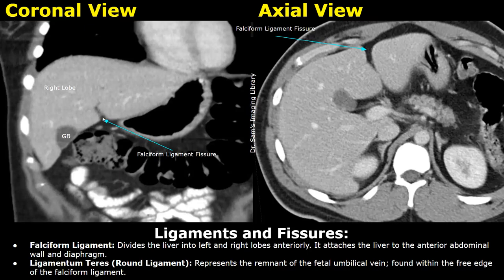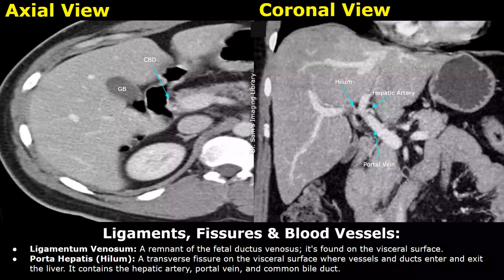Here we will get a better look at the ligaments and fissures of the liver. This hypodense dark line is the falciform ligament fissure, which divides the liver into right and left lobes. The ligamentum teres is a remnant of the fetal umbilical vein; it is found at the free end of the falciform ligament, but in a CT image it is not really visualized well. The ligamentum venosum is a remnant of the fetal ductus venosus; it is found at the inferior visceral surface, but in a CT image it is also difficult to see.